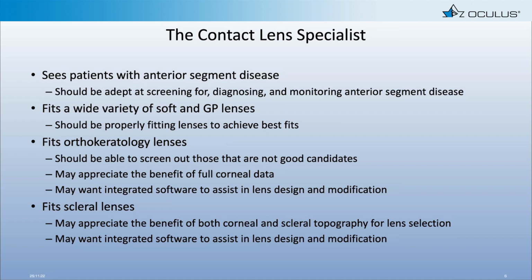So again, to fit basic lenses properly, we need to have that information about the anterior segment. And then the contact lens specialist of today is probably in many cases fitting Ortho-K lenses and scleral lenses.